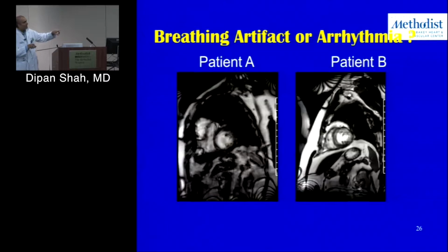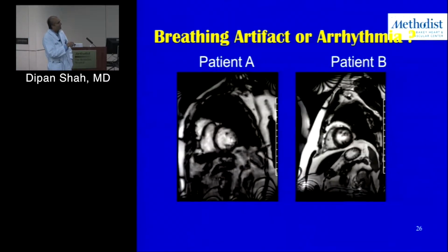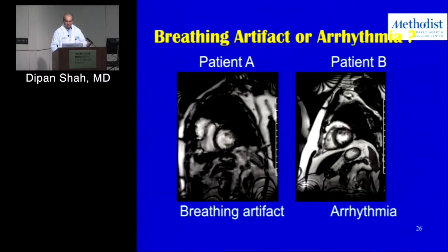If you look on this side, abdominal organs look normal. And then the other thing is if you look at the very first frame, it actually doesn't look blurry, because again, the very onset of the R-R interval is essentially the heart's in the same position each time. So identifying what the problem is will allow you then to go on and fix the problem.